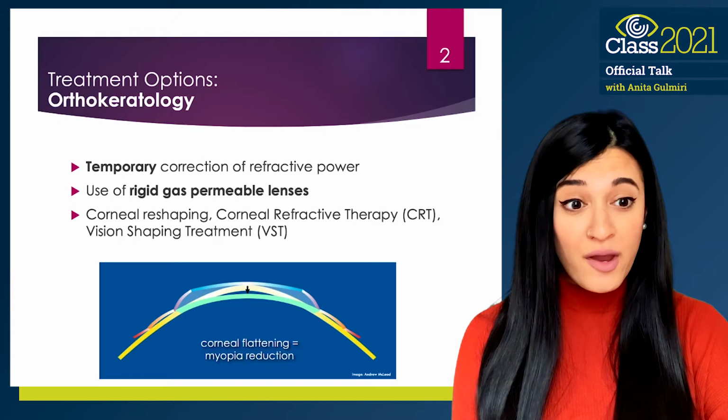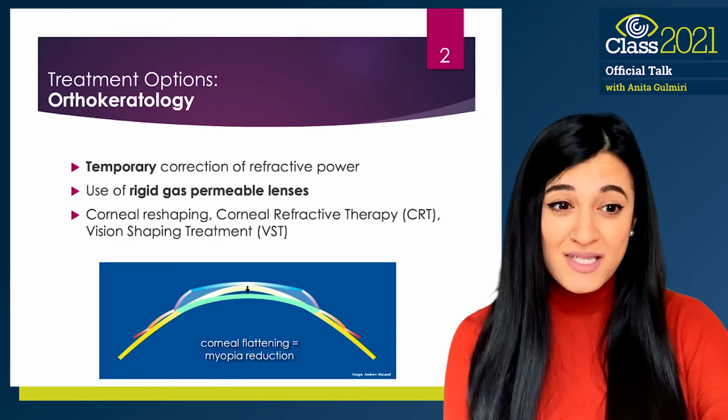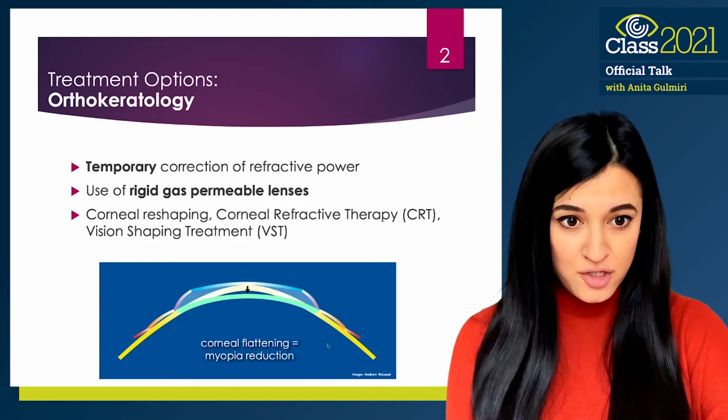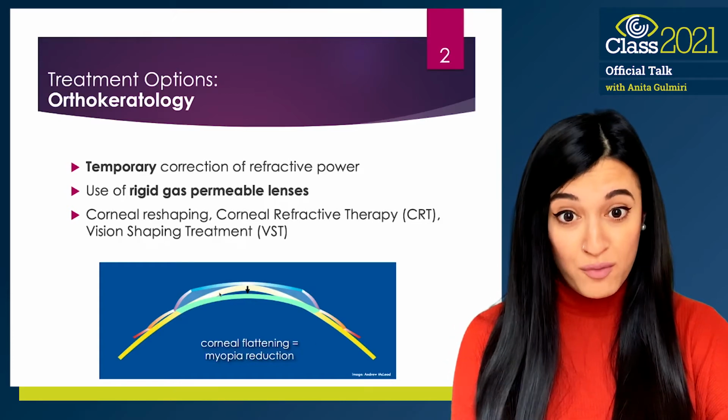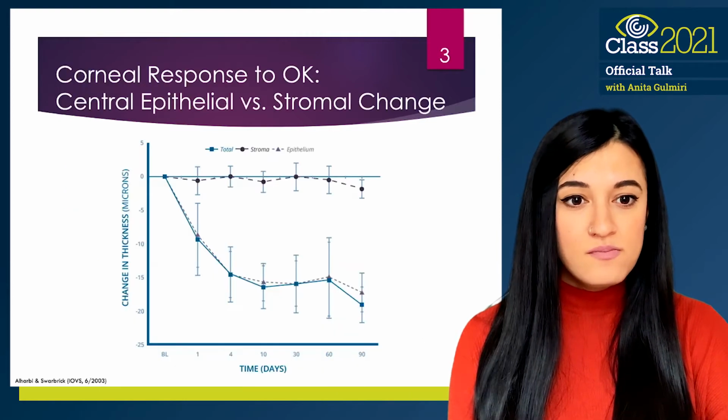Other names of orthokeratology that you may have heard of are corneal reshaping, and treatment systems and lens designs that you may be familiar with are corneal refractive therapy and vision shaping treatment.